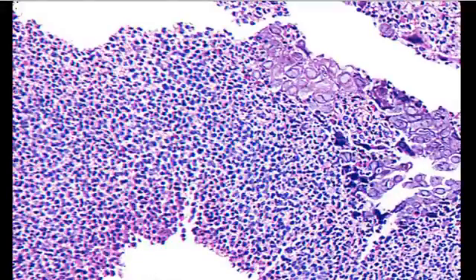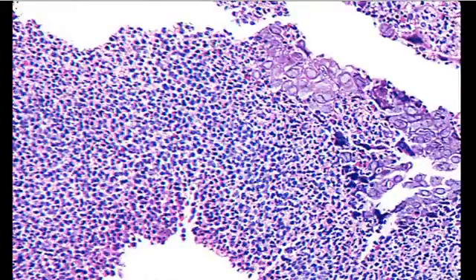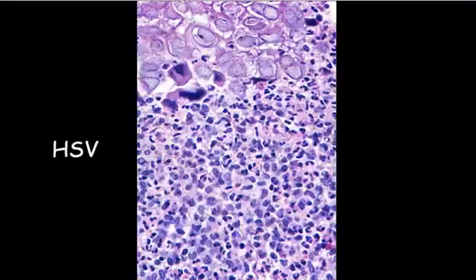And then 2 days later, I got another case of herpes esophagitis that had the same macrophages, and that sent me on a hunt to pull out all the herpes esophagitis cases here at Hopkins, and I discovered that virtually every case had this macrophage exudate. So when you see these macrophages, think about HSV if you don't see the infected epithelium. They often get pushed together into big sheets by the biopsy forceps.